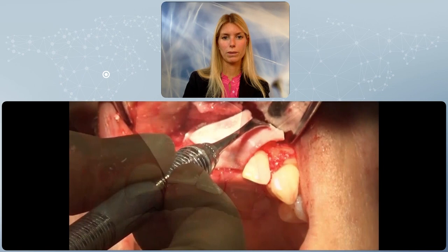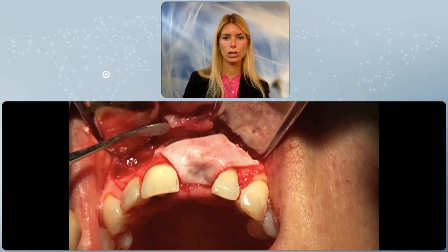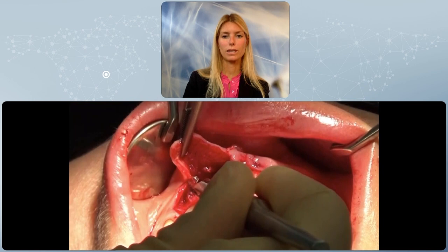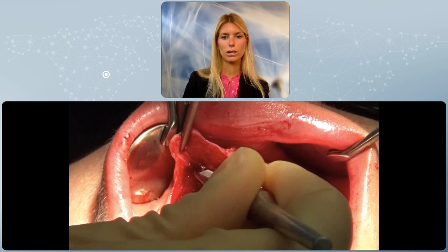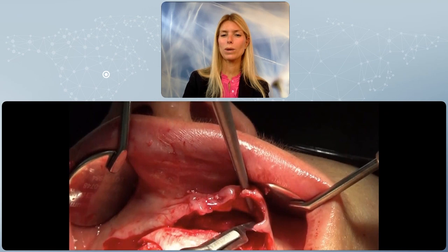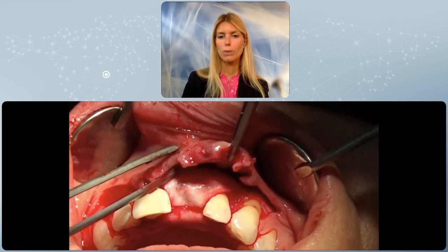And now this is the most crucial portion, which is the releasing incision of the periosteum to allow a completely tension-free and passive flap. As you may notice, the flap has to almost arrive at the incisal edge of the teeth, and this is what we would call a completely tension-free flap, considering that the palatal flap cannot be released by any means. Now, a horizontal mattress suture is always performed. And by the way, the protocol is always the same, whether we're dealing with the anterior aesthetic region or the posterior mandible, the protocol is always the same. We never make up things on the way.